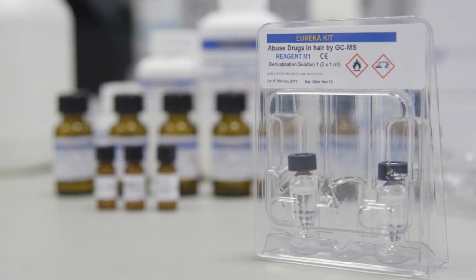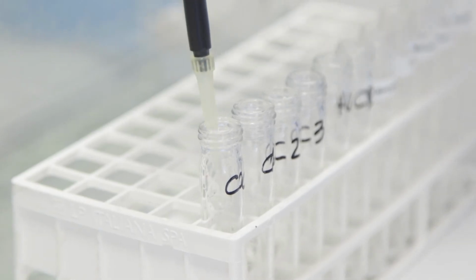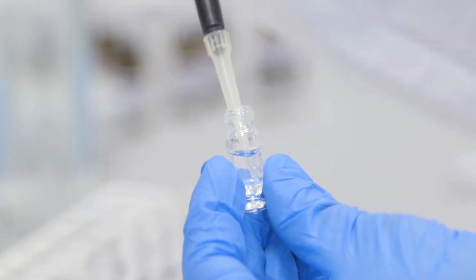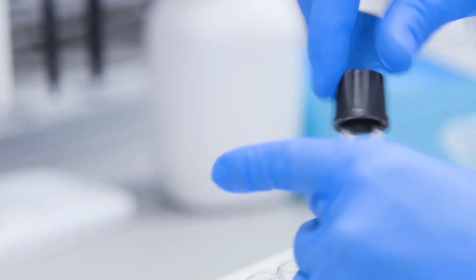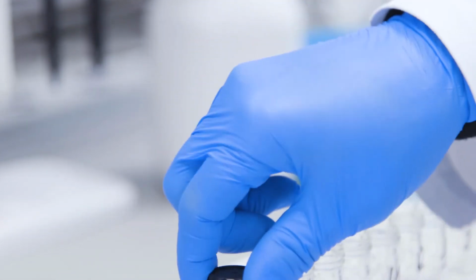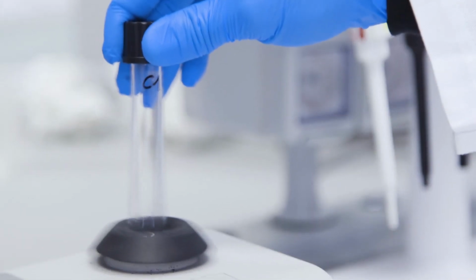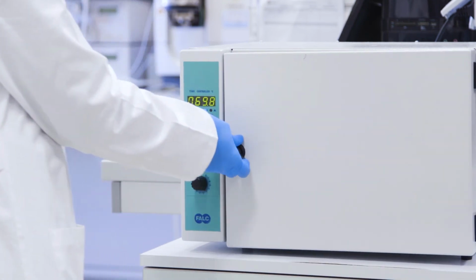At this point, add 25 microliters of reagent M1, derivatization solution 1, plus 25 microliters of reagent M2, derivatization solution 2. Close the tube tightly with a cap and vortex for 20 seconds. Then put in an oven at 70 degrees Celsius for 20 minutes.